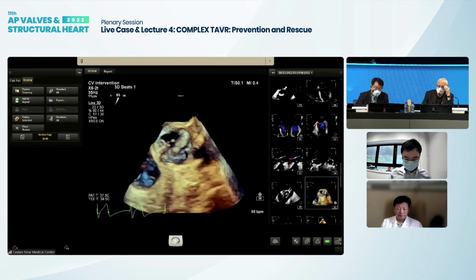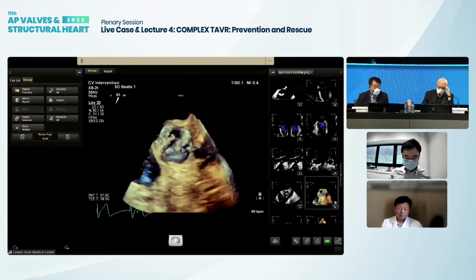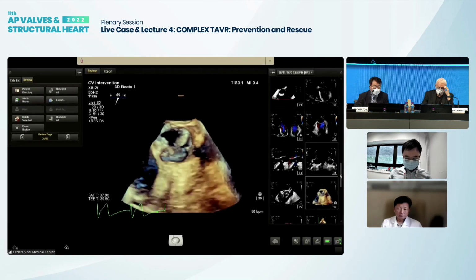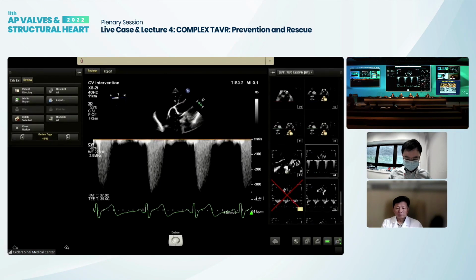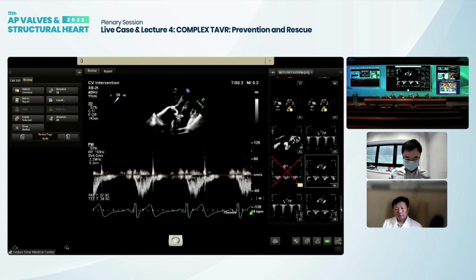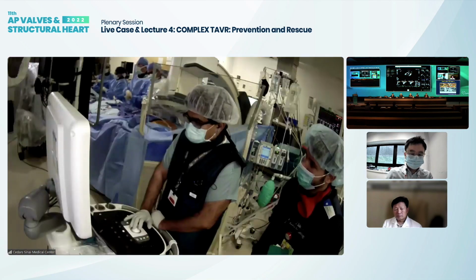As was mentioned earlier, definitely a lot of calcification, especially in the region of the left coronary cusp here, slightly away from the raphe. Fortunately, the ostium of left main is okay and away from this. And again, the hemodynamic data we gathered supported a diagnosis of significant aortic stenosis with a dimensionless index of 0.23. Otherwise, no other structural issues identified with the valve. Importantly, no mitral regurgitation or pericardial effusion. Sid, thank you very much.